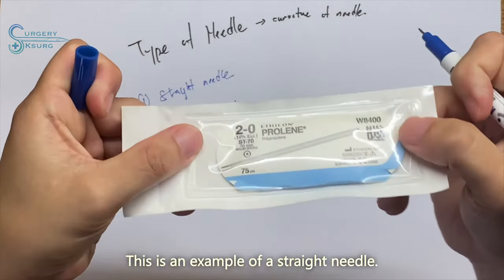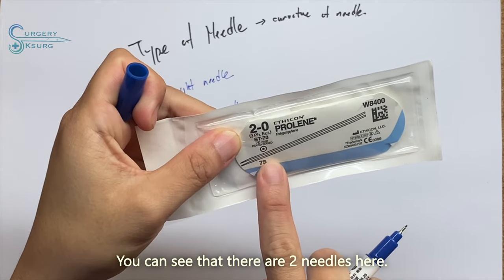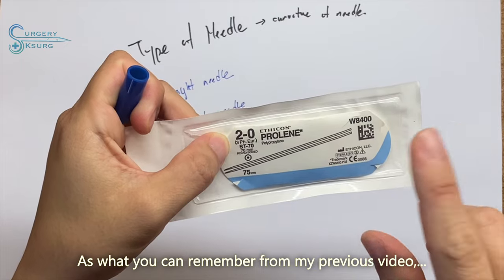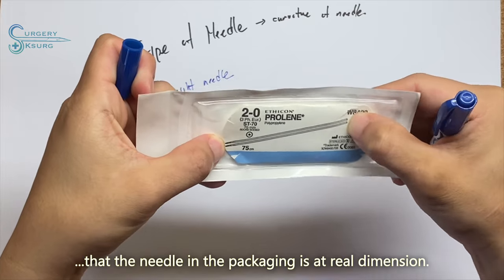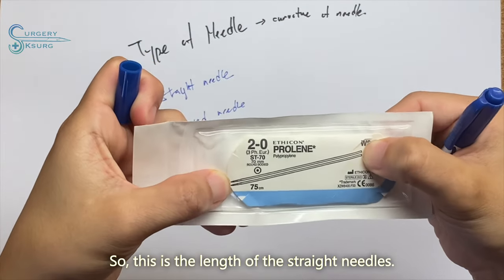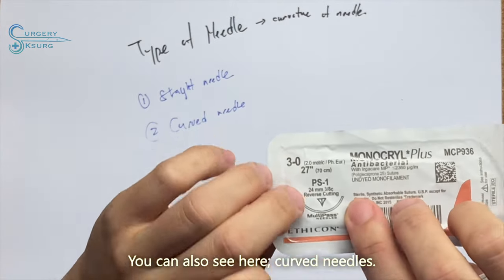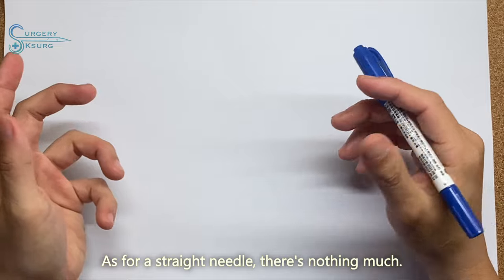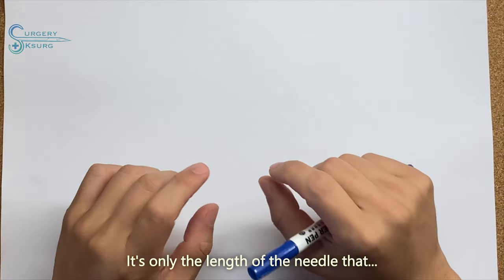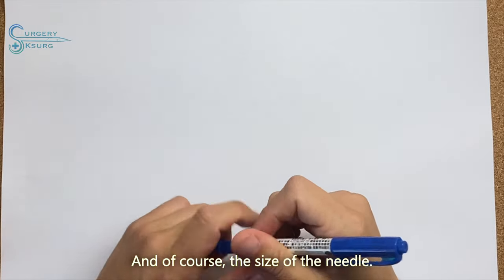So this is an example of a straight needle. You can see that there are actually two needles here. As you remember from my previous video, the packaging is actually real dimension. So this is the length of the straight needle. You can see straight needles, and you can also see a curved needle. As for a straight needle, it's nothing much. It's only the length of the needle that makes the difference, and also of course the size of the needle. We don't go into that.